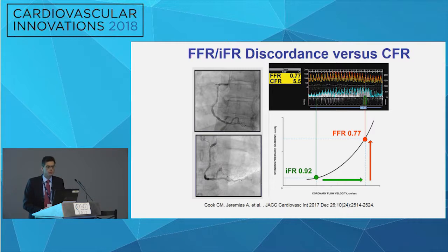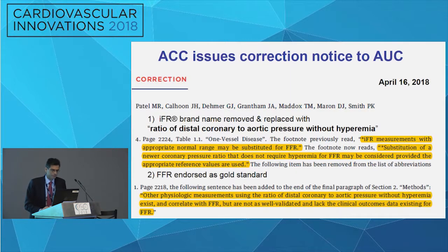Would any of you ever do Doppler for assessing coronary flow reserve? No, and I think most people clinically don't do it because it's the Doppler wire, which people don't use, just much more cumbersome to use. But most people use just the standard FFR.